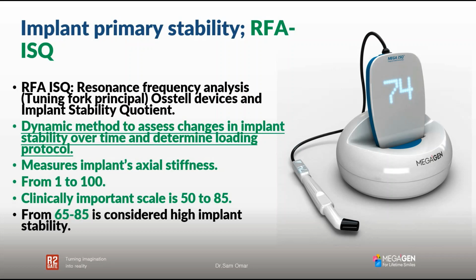And you need to know that resonance frequency analysis is a more dynamic method to assess the changes in the implant stability over time and determine the loading protocol. So it's a dynamic method, unlike insertion torque. We said you only measure insertion torque once, but you measure ISQ over time, and it's a repeatable measurement.